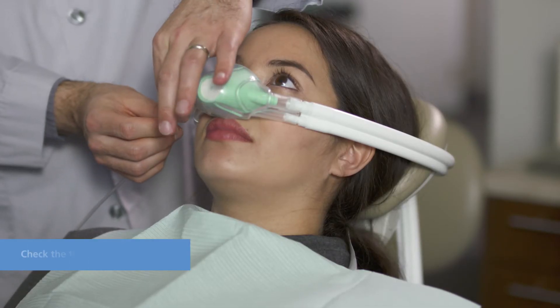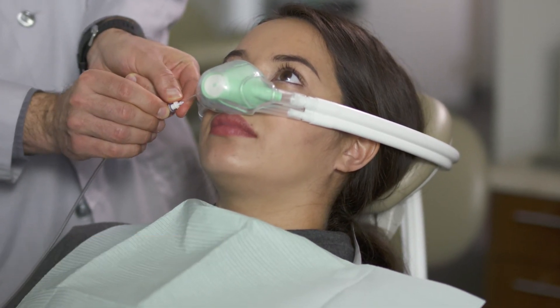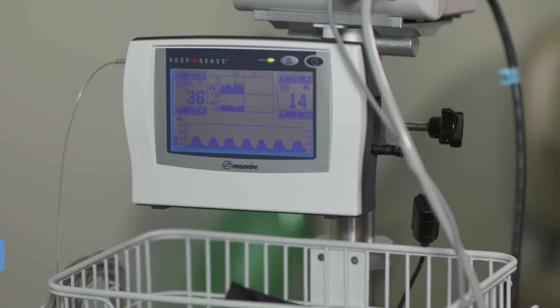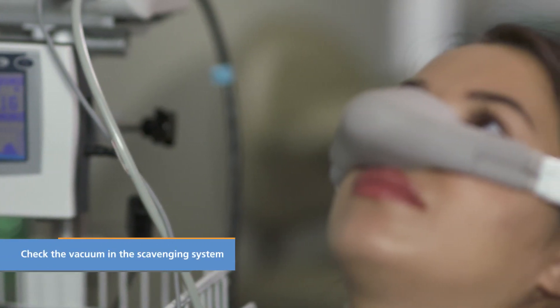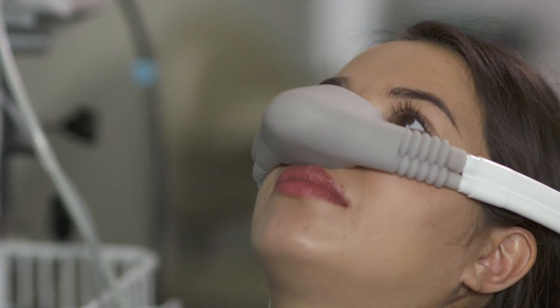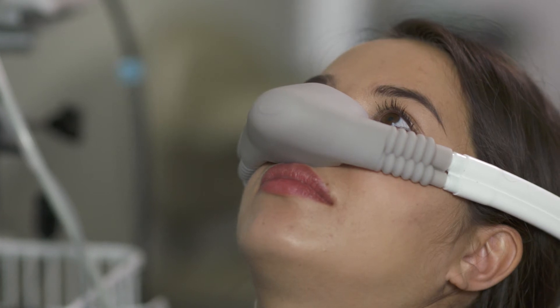Check the flow in the nasal hood. A high oxygen flow may be diluting the CO2 in the sampled air. Finally, check the vacuum in the scavenging system. A high vacuum can oppose the pump in the monitor and reduce the CO2 in the sampled air.